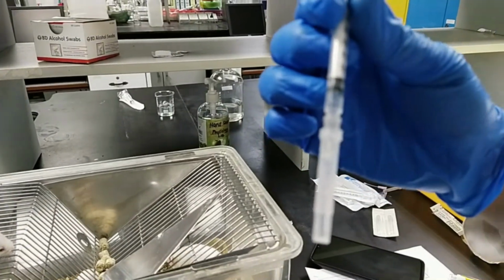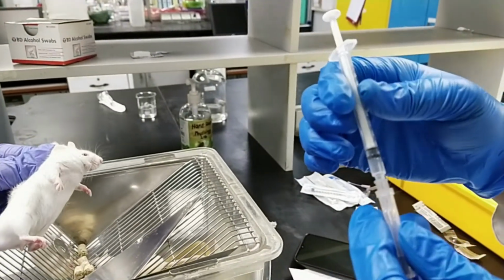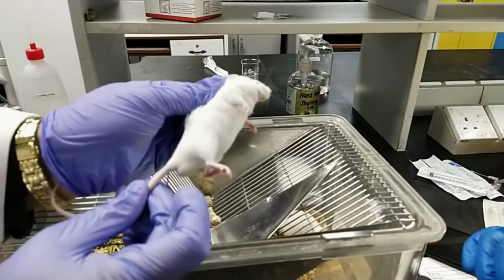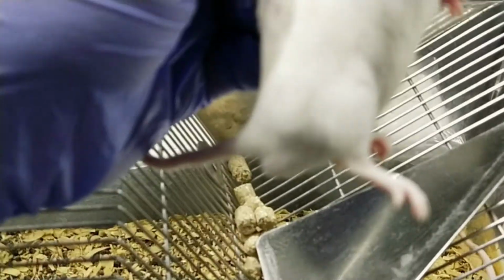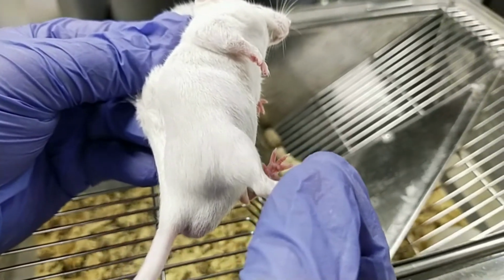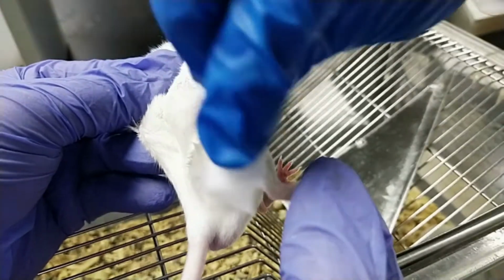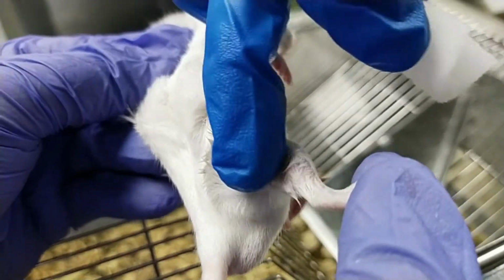So now we're going to proceed with the third injection, which is the intramuscular injection. So similar to the previous injection, we're going to inject 0.13 ml of ketamine directly into the muscle. So this is the location of the muscle that we're going to choose, which is around the thigh area. So before injection, you need to apply the alcohol swab at the injection area. So as you can see here, this is the muscle that I'm going to inject.